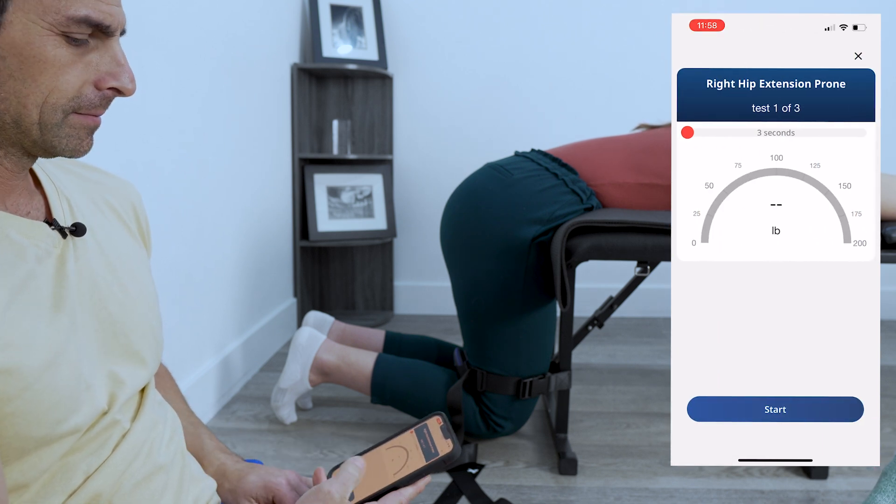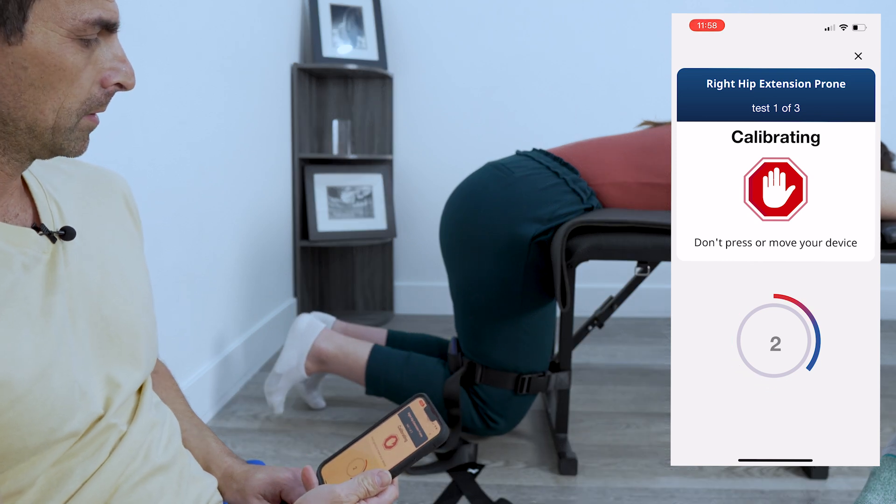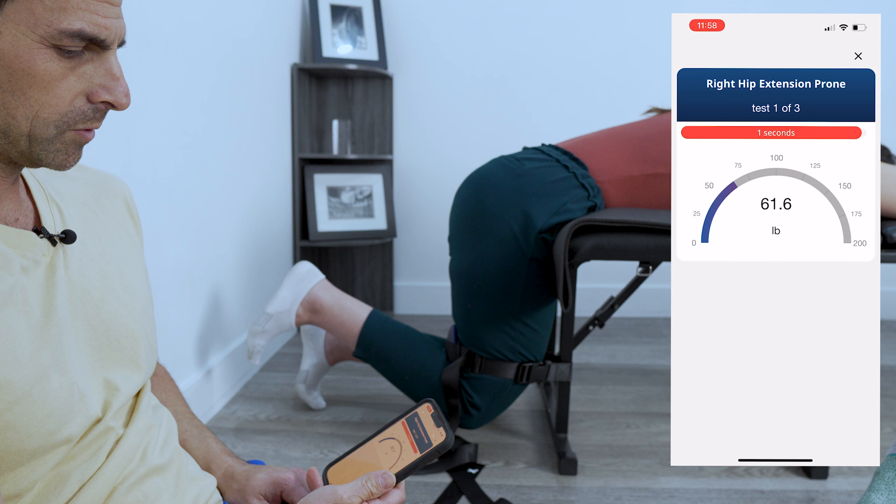Okay, Dawn are you ready? Three, two, one — push, push, push, push, push, push, push, push, push.